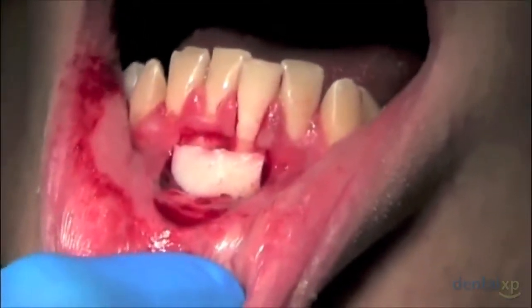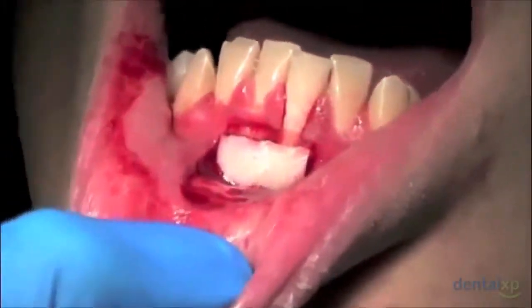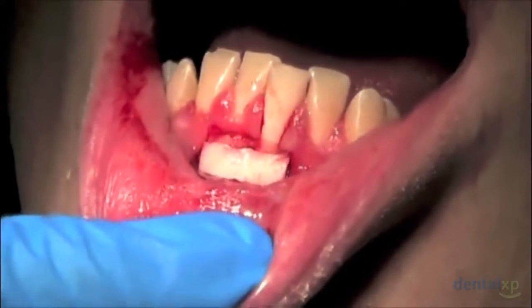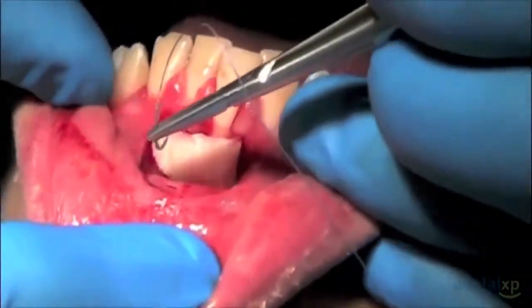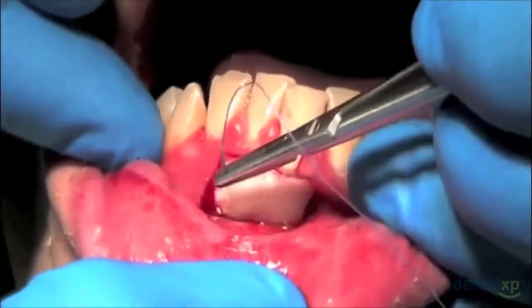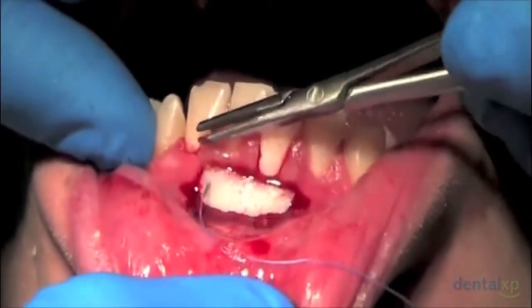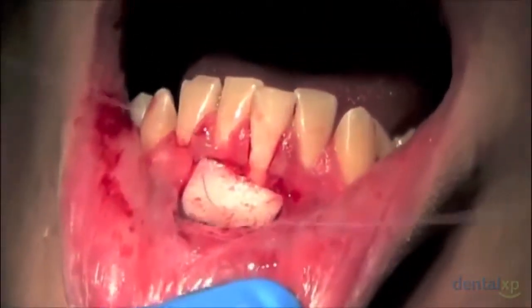The free gingival graft is now being placed over the recipient bed and checked for accuracy here. All we're looking for is a nice butt joint of the graft to the recipient bed. And the next step here will be to suture the graft in place. And as I just showed you here, we're going to use a 5/0 vicryl suture. The way I like to suture the graft in place is by simply placing 3 interrupted sutures along the coronal aspect of the graft in the areas of the papilla.